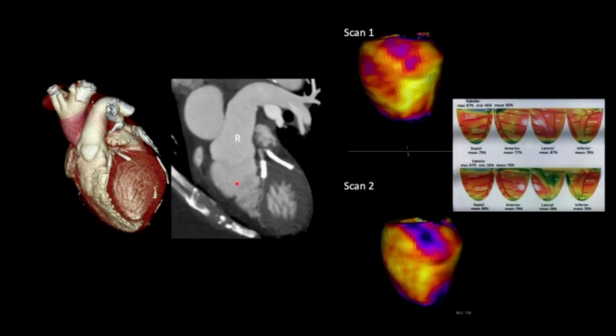Another patient, where sometimes the anatomy doesn't help much. We can't see through stents. If you notice, the flow distal to the stent is not exactly the grade. The opacification is not quite there. Scan 2 is stress, adenosine stress. Scan 1 is rest. A relatively small area of intense ischemia exactly in this territory. This area was exactly the same area that the PET scan in the same patient had seen, and the in-stent restenosis was confirmed by cardiac catheterization.